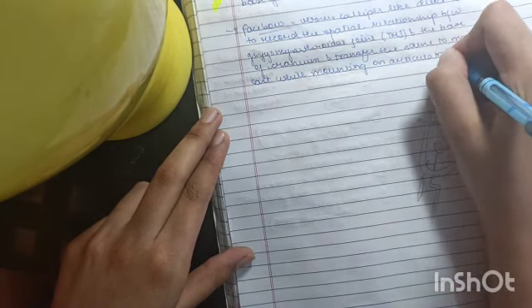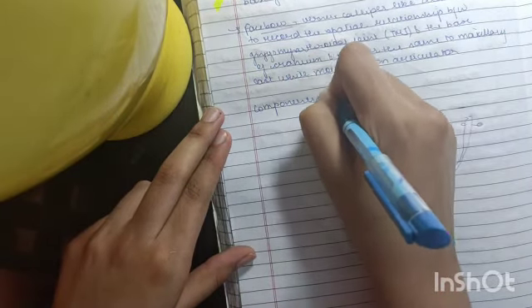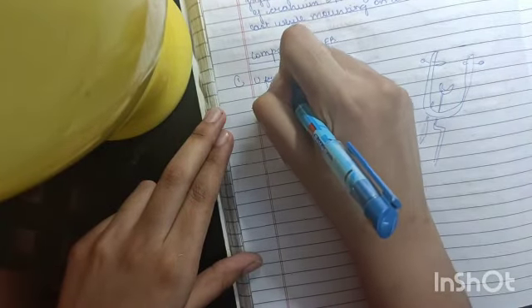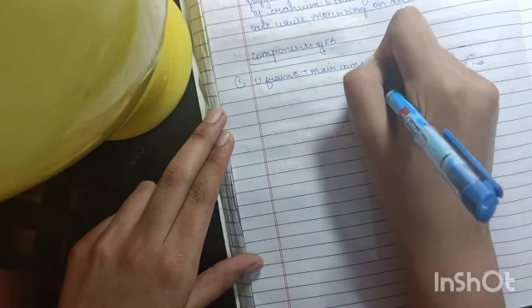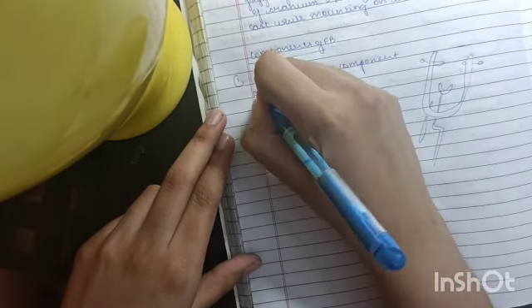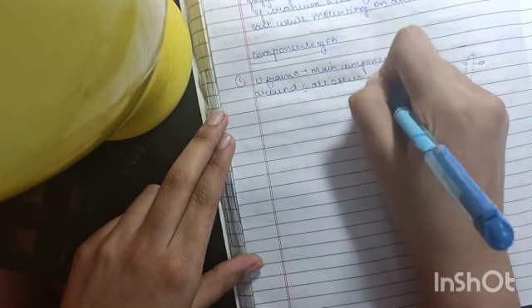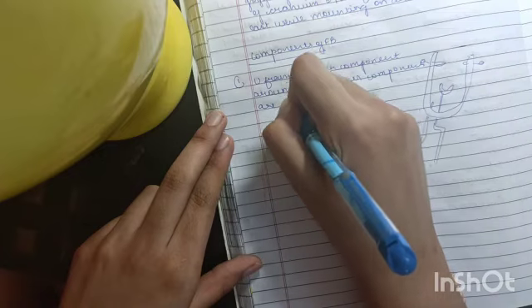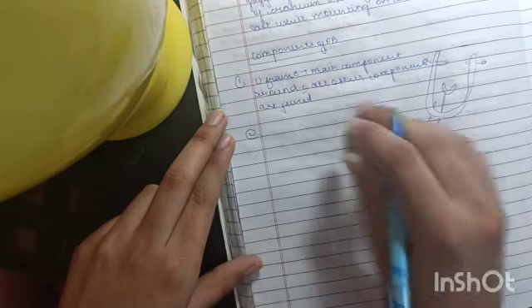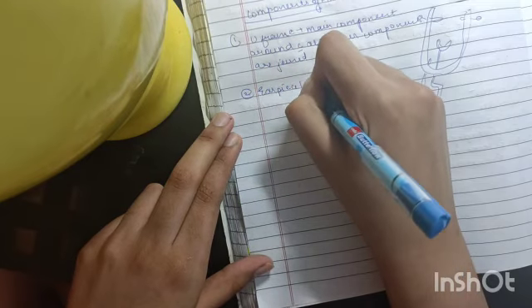Now coming on to the components of face bow. First is the U frame. It is the main component around which all other components are joined. Then we have the earpiece or earplugs.